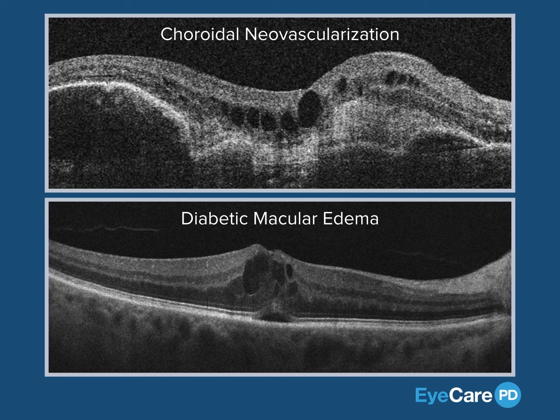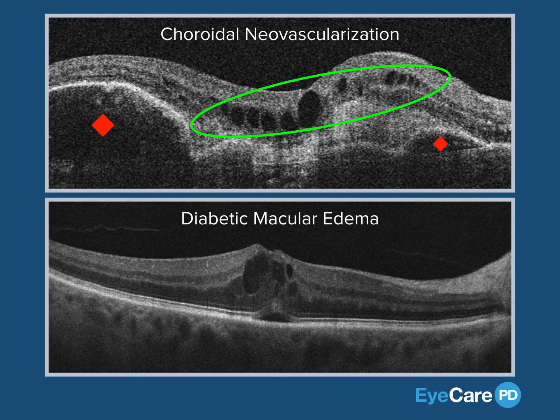For example, in the top image you note intra-retinal fluid, in combination with multiple pigment epithelial detachments and subretinal hyperreflective material. Thus, this is most likely an OCT image from a patient with choroidal neovascularization.